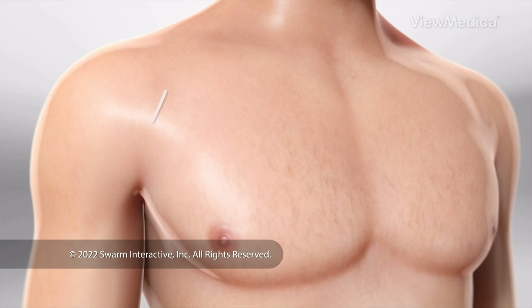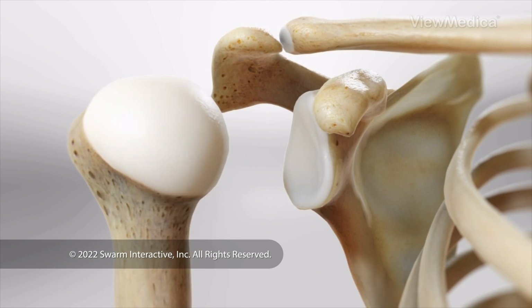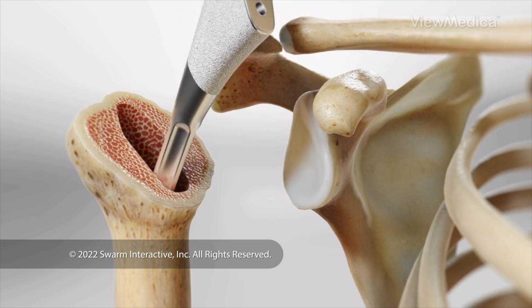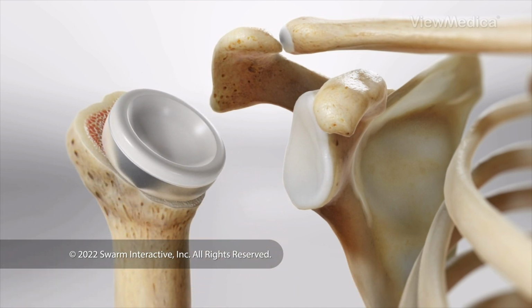We make an incision to reach your joint. First, we modify the humerus. That's the bone of your upper arm. We take off the head of the humerus and make space in this bone for the implant. The implant's stem slides into the bone's center. We attach a cup to the top. This is the shoulder's new socket.